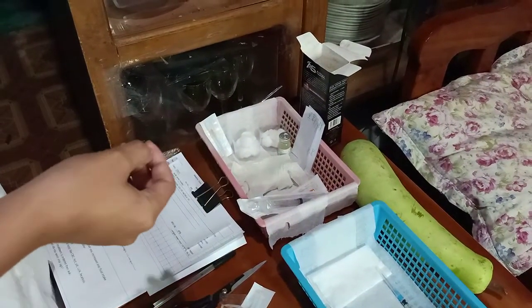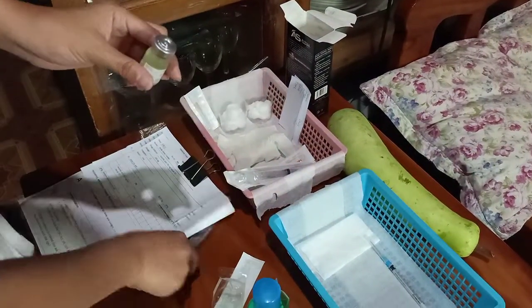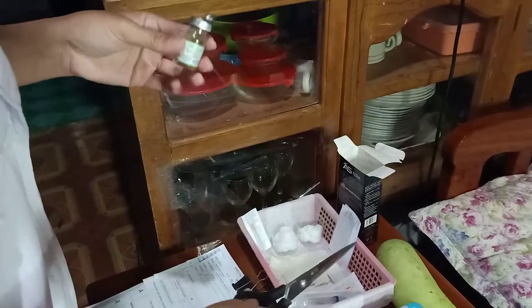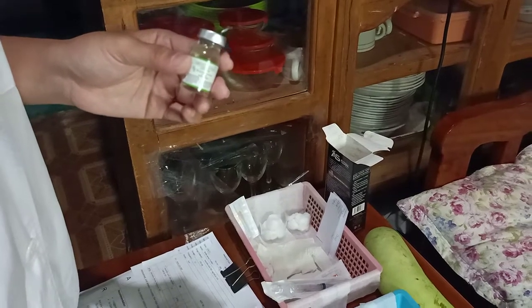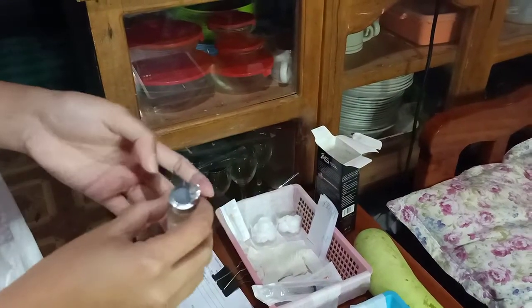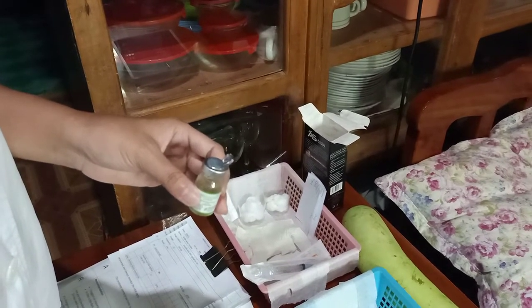Next, proceed to preparing the medication vials. Open the medication vials. Now that the rubber seal of the vial is exposed, clean the surface of the rubber seal using a wet cotton ball with 70% alcohol.